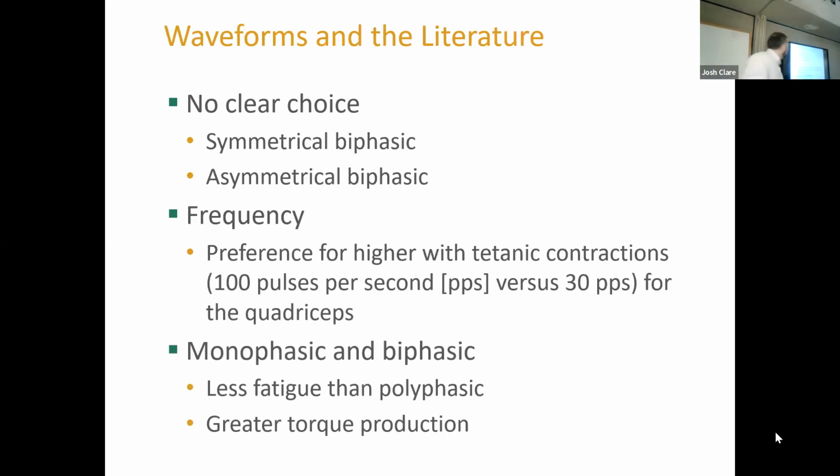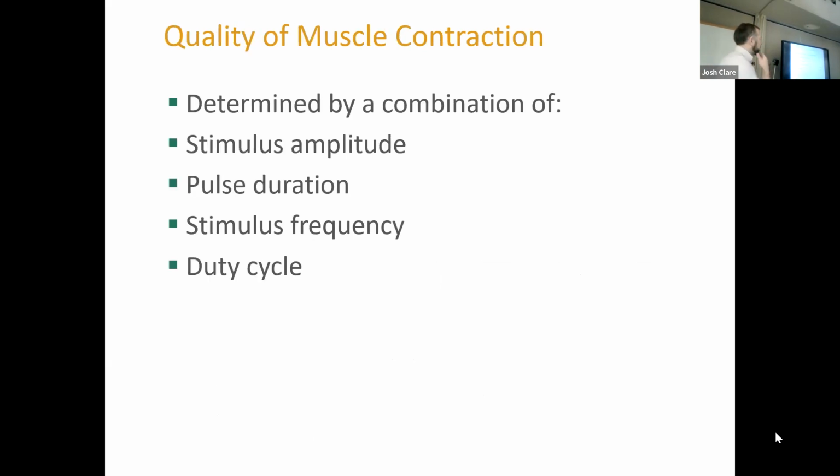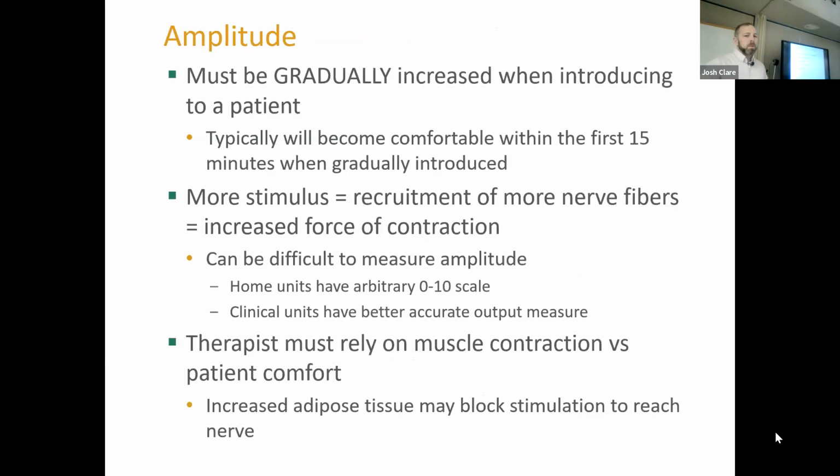So waveforms, no clear choice. Symmetrical biphasic, asymmetrical biphasic. There's not a clear choice. I'm going to show you 2 different forms that I'm going to use. For frequency, higher frequency for tetanic contractions, 100 pulses per second versus 30. We'll look at some of those parameters in just a little bit. So the quality of contraction is going to be because of the amplitude, how much stimulus we give them, the pulse duration, the frequency, and the duty cycle.